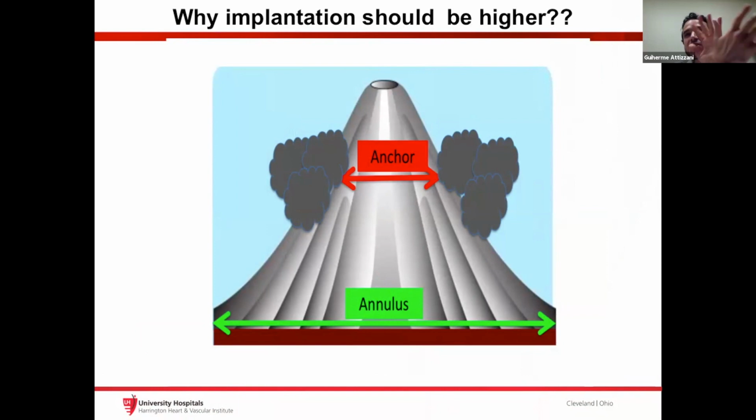Not really, Sushil. When I go LAO, I'm happy, because the question is, if we're going to react all the time to this, I'm not sure what is the appropriate reaction. Should we remove the valve and pre-dilate more aggressively? I don't think we have a clear answer for that.